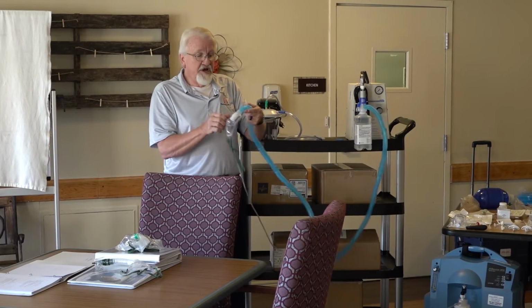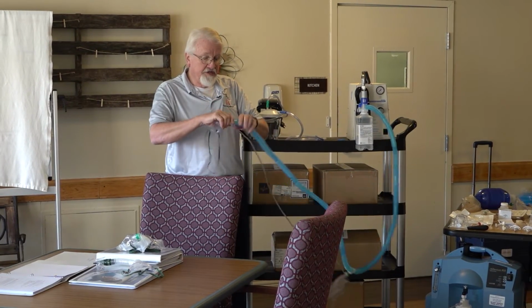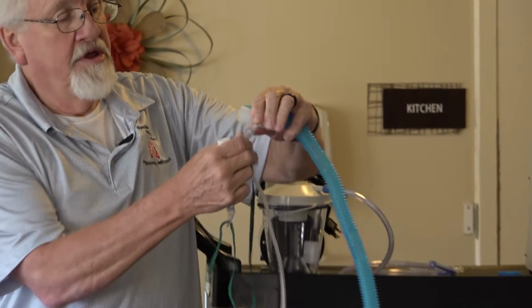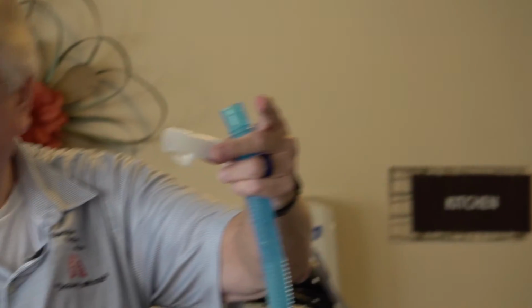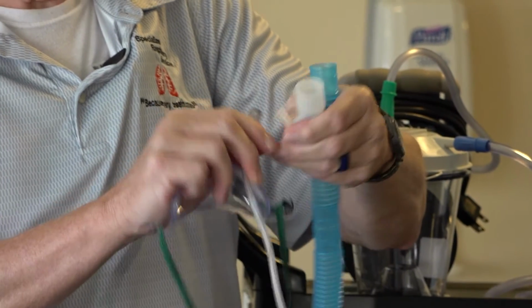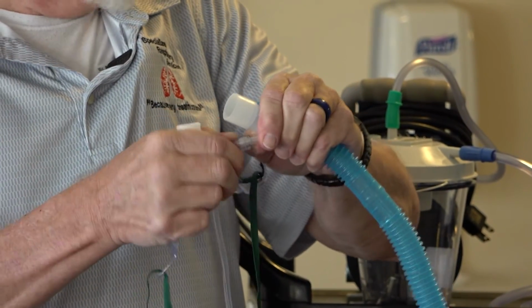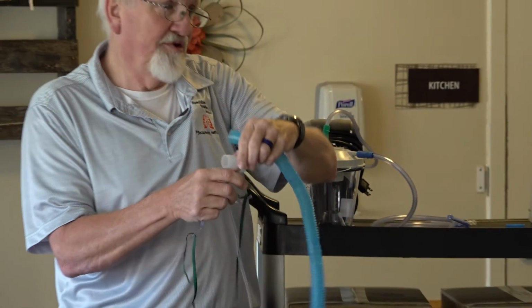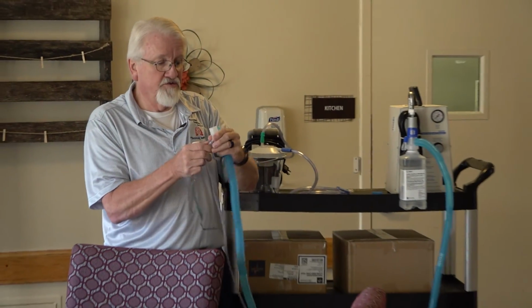Next in line is going to be, this is a fitting all its own, the O2 bleed-in fitting. Okay, and so this is how we're going to provide the patient oxygen. Remember, that compressor over there only gives air. So this doesn't have anything to do with his oxygen level, okay? That's only air.